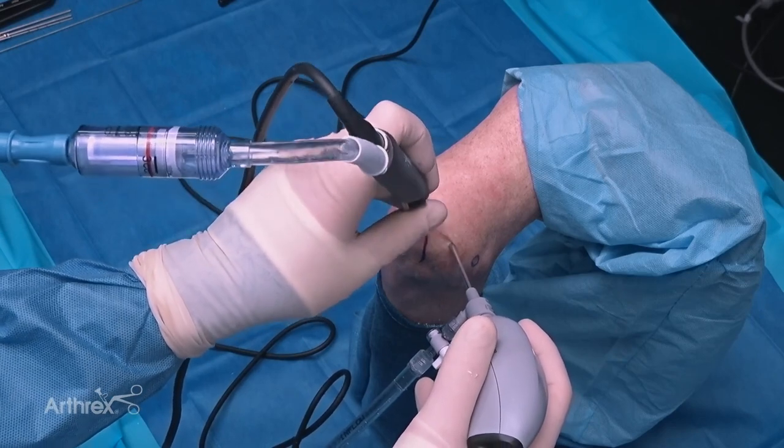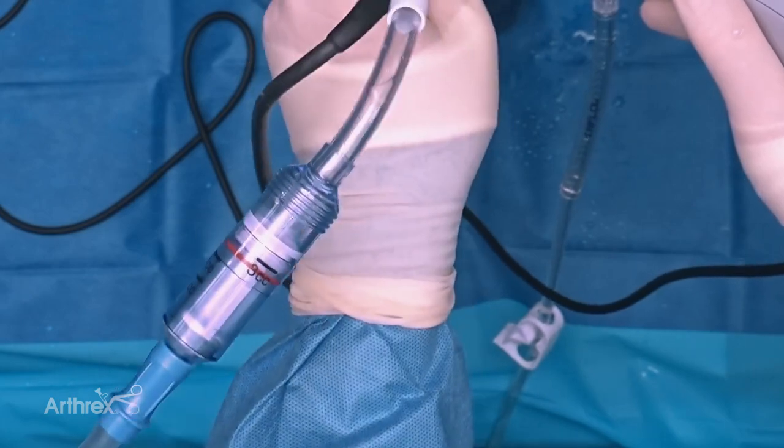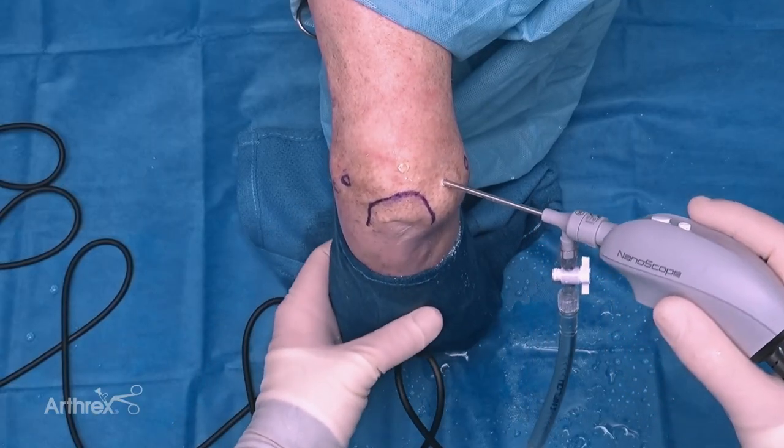Now that we've identified our chondral defect and started to repair it, we've applied the graph net to our suction device, so that's going to help us collect the debris as we continue to debride the area. We've now cleaned a large portion of that chondrocalcinosis out of the olecranon fossa, and you can see as I extend the elbow the tip of the olecranon coming up.